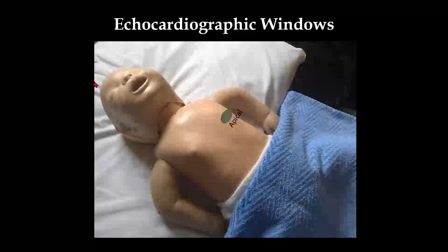Parasternal views are divided into two: low parasternal and high parasternal. What I am drawing is the nipple line. These are the two nipples, and this is the nipple line. And then you have the sternum.